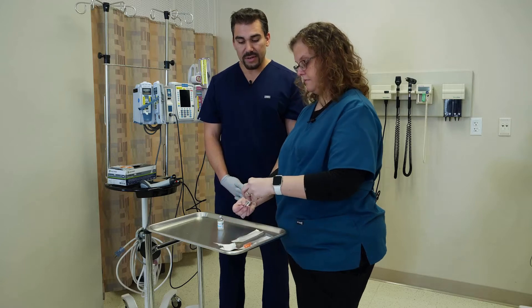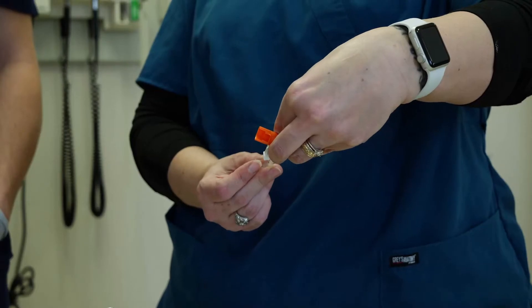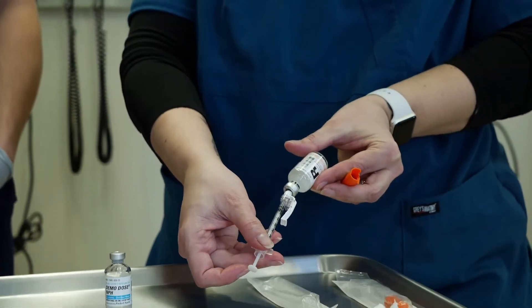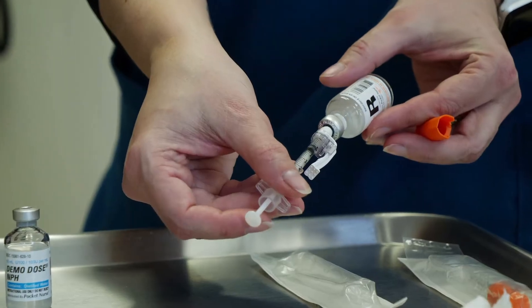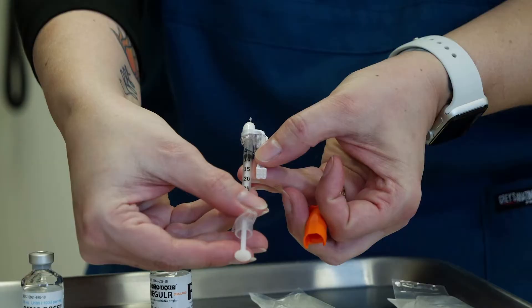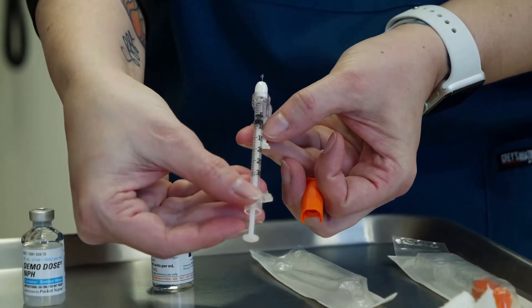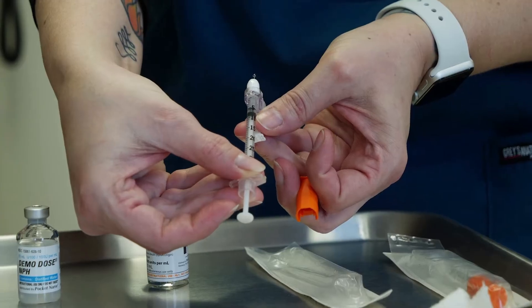Now we're going to pull it over — it's hard to see, but we have a needle in there and we're going to pull it out right to the line. If you can't see it, I'm going to pull this off. This actually moves around so that you can get a better view of your graduations — it's not static, you can move it.